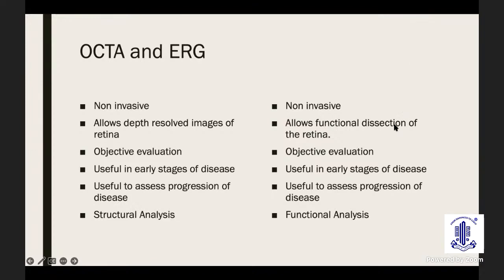Both are objective evaluations of the retina. Both are useful in the early stages of the disease and useful to assess progression of disease.